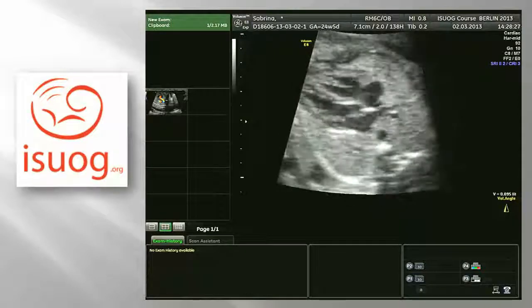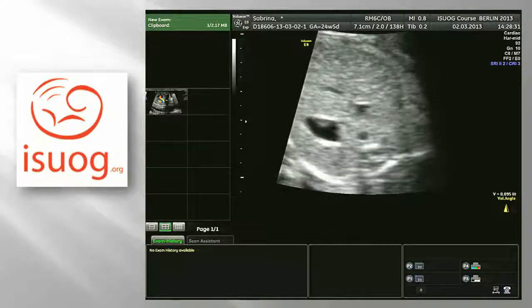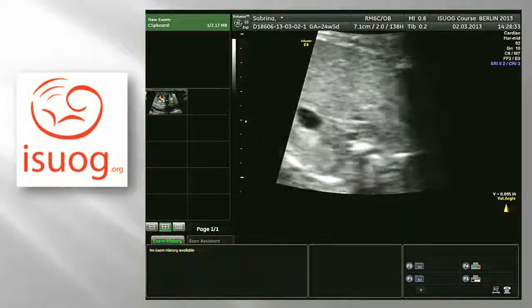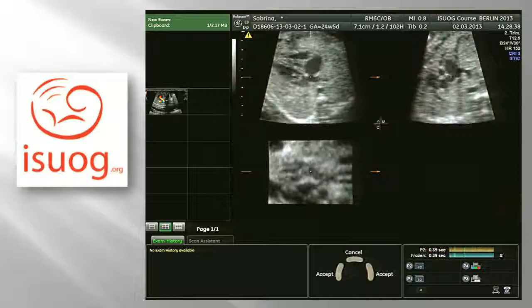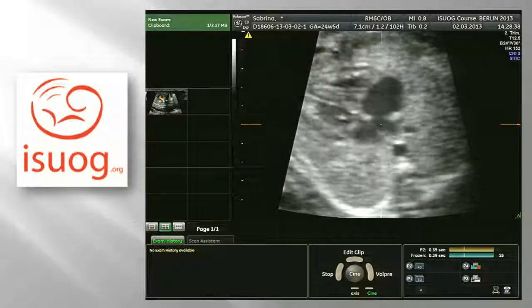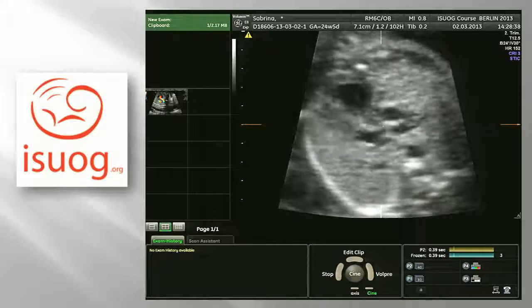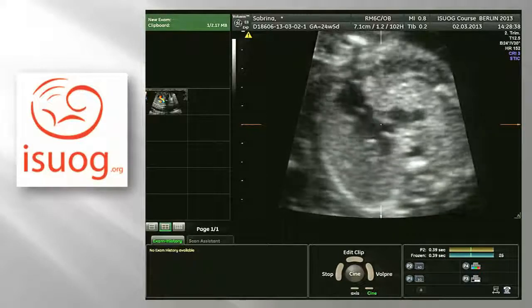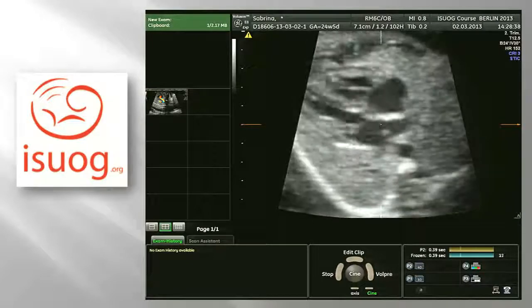During the acquisition process, you will see if all the structures of the heart are inside the fetal box. We have not really fetal movements, it is okay. So 152 beats per minute. First I increased plane A, I reduced the speed so that I see all the different structures, and now I perform a vertical examination with the course of the pulmonary trunk, and you see the right ductal arch.